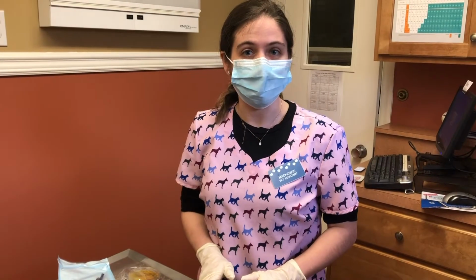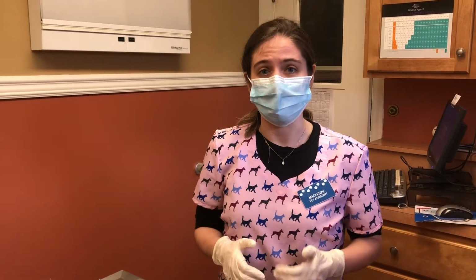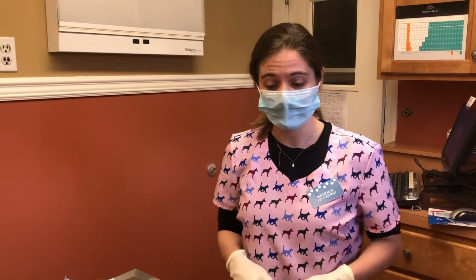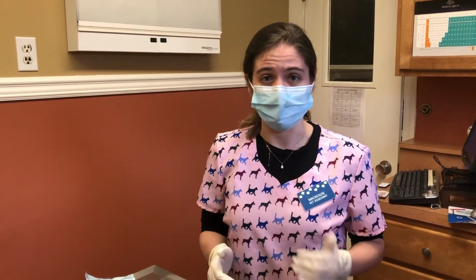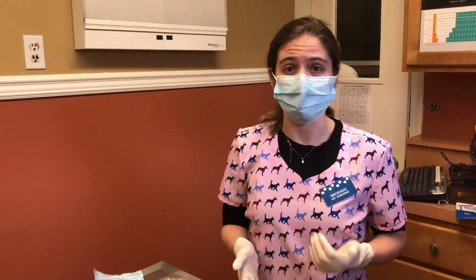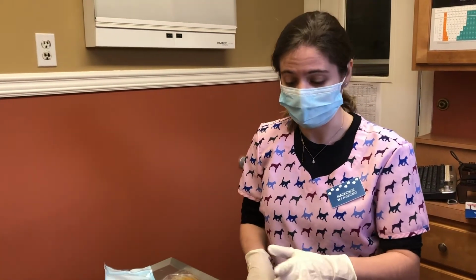In this video, I'm going to demonstrate how to collect the sample and evaluate the samples for dermatological and fungal testing. In this case, we're going to be looking for a fungal organism known as dermatophytes. Dermatophytes are found on the hair shafts of dogs and cats, and they can cause irritation. So when a dog or cat suspected of having a dermatological issue comes to the hospital, they are going to present with scaly skin, active lesions of hair loss, and some broken hair shafts.